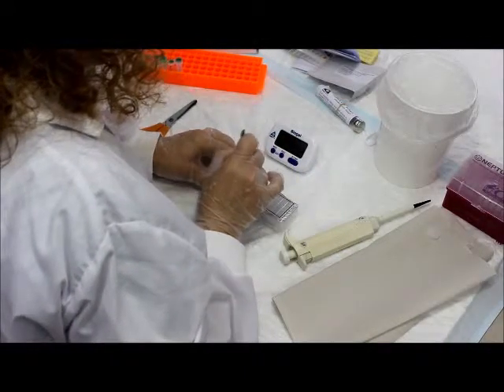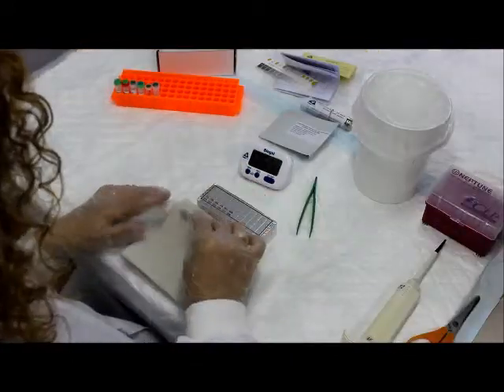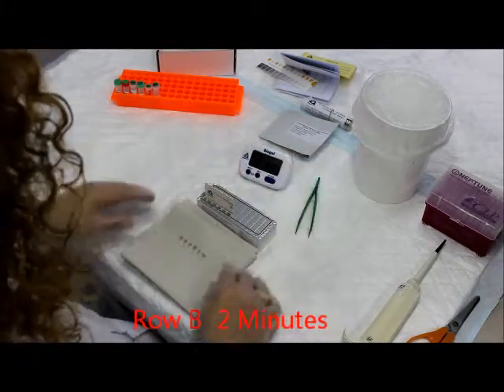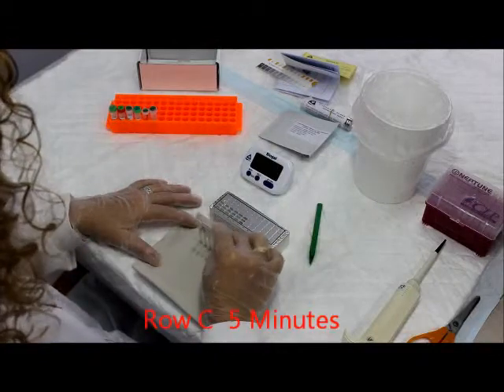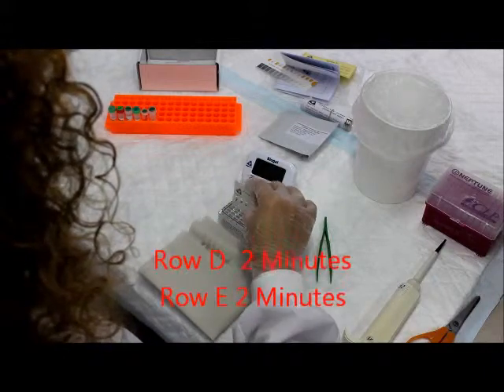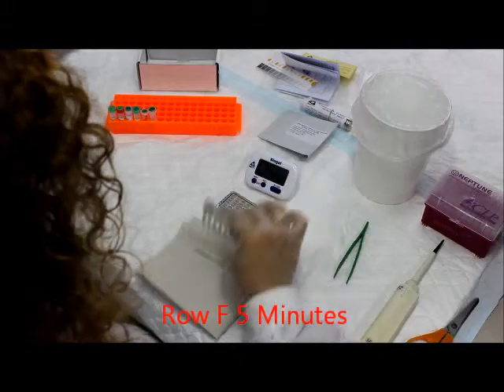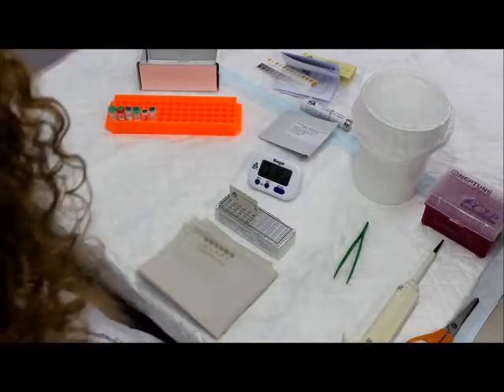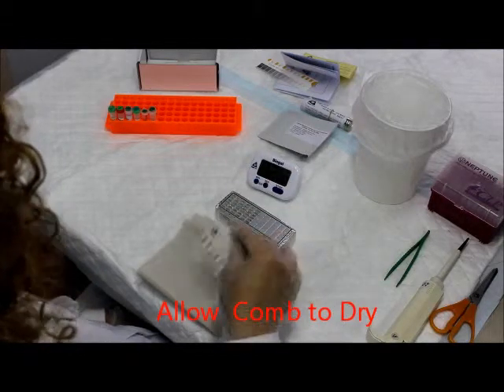Use tweezers to pierce the foil in the next row, which would be row B, and insert comb for 2 minutes. Gently shake off excess liquid from the comb teeth onto a piece of tissue. Insert the comb into the next well, row C, for 5 minutes. Place the comb into the remaining wells, row D and E, for 2 minutes, and the last well, which is row F, for 5 minutes. Upon completion of the color development in row F, move the comb back to row E for the next 2 minutes for color fixation. Take the comb out and let the comb dry for 1 to 10 minutes.